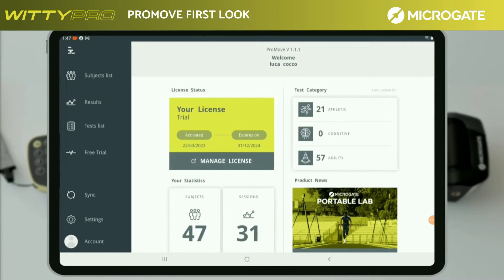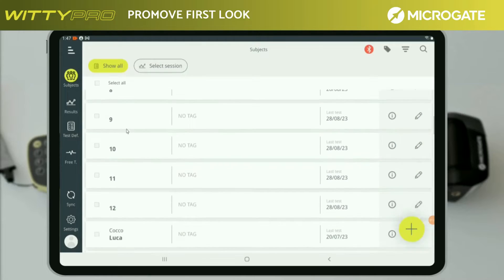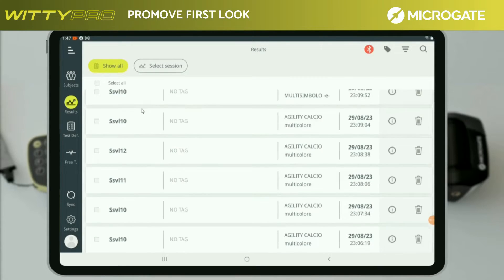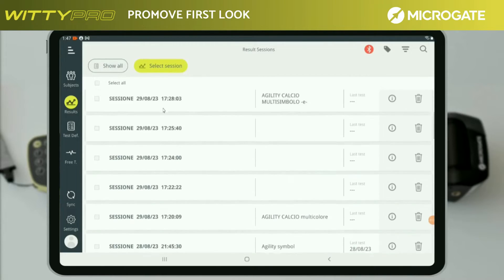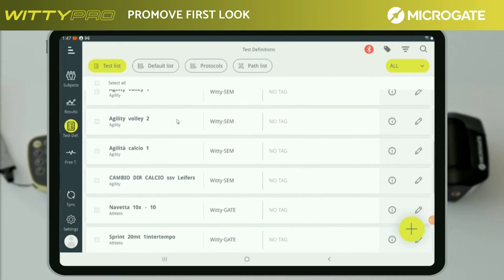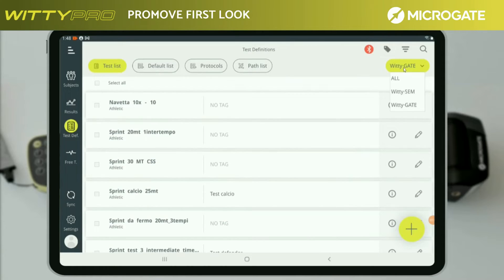On the left side, the app presents a scrolling menu with a selection icon for the subjects with the list of subjects previously entered. It is also possible to create more athletes, as we will see in detail later. The results menu shows the lists of tests performed, and on this screen you can also see the sessions made. The tests definition section with different icons like test list, default list, protocols, and path list will show you all the tests made previously. An icon on the left-hand side allows only the tests of a predefined system to be highlighted for easy searching. This menu gives you the possibility to create, on the trial and pro license versions, all the tests and protocols you need.